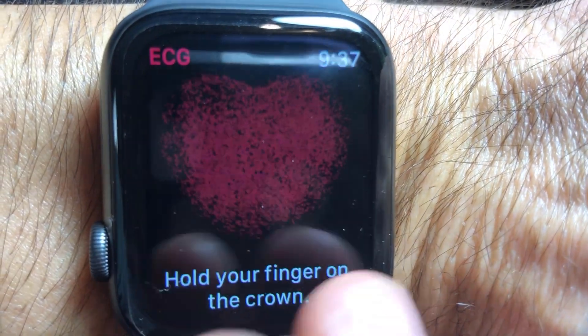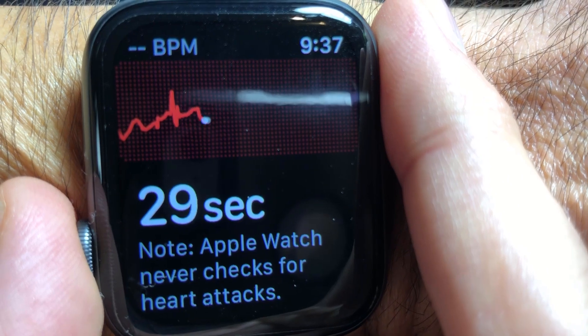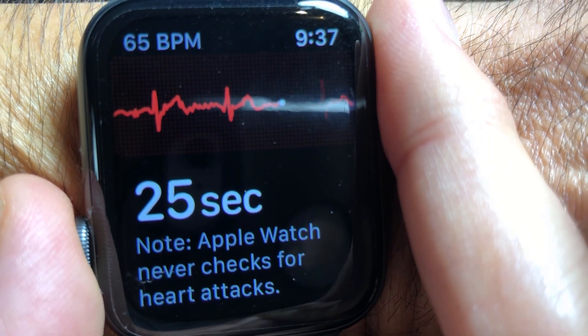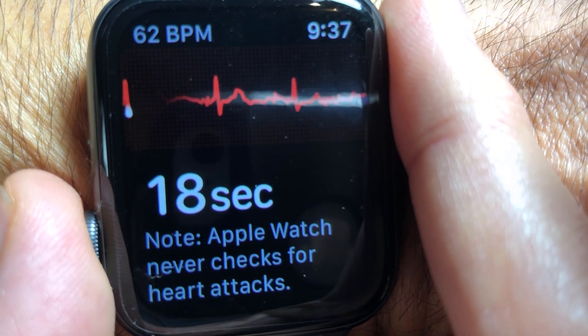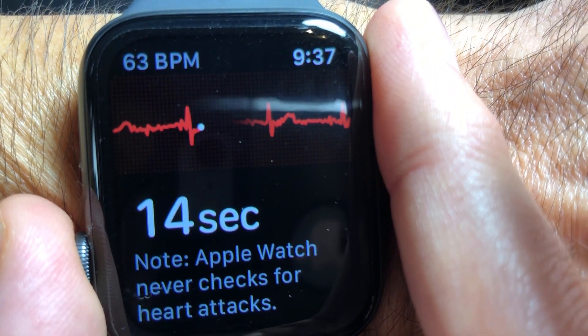To use Apple's new EKG app, you're simply going to click on your watch, the ECG, and then hold down, making sure that you're holding on the crown and it's on your wrist. For 30 seconds, you're going to see your heart rate and you're going to see the little ECG monitor go across the screen. You're going to hold it there for 30 seconds.